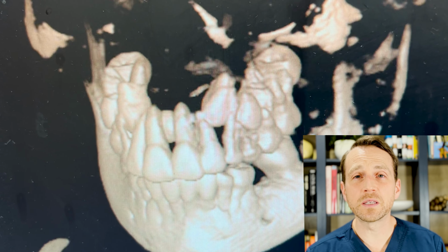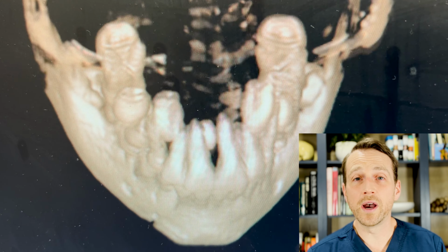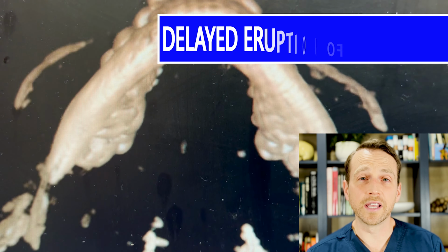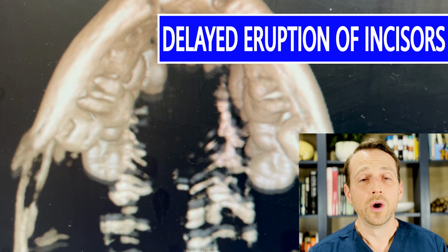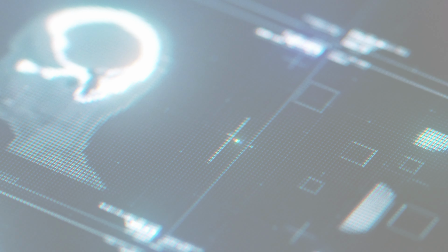Mesiodens are typically asymptomatic and are noted on radiographic exam. Patients sometimes have no idea that there is a Mesiodens present. Other times there are clues such as delayed eruption of the central incisors or ectopic eruption. If Mesiodens interfere with the appropriate eruption of teeth 8 and 9, then I remove them earlier in life. However, in this case, teeth 8 and 9 erupted appropriately, so we're really at an ideal time to remove them right now. The root structures of teeth 8 and 9 are fully formed, which means that they are solid in the alveolar bone.